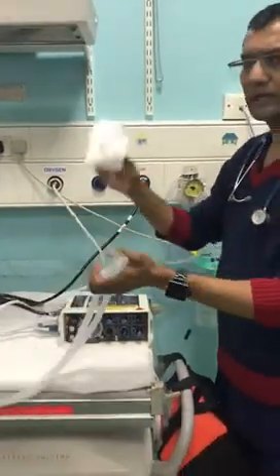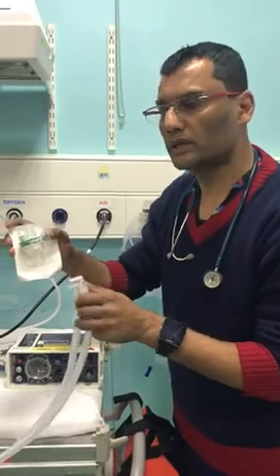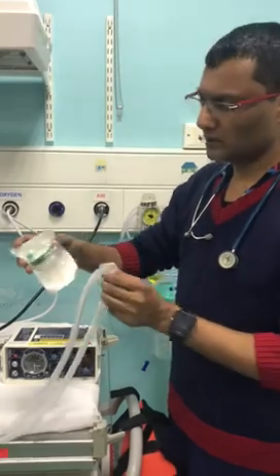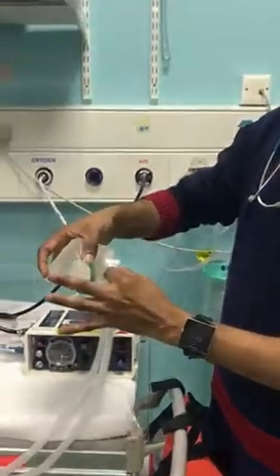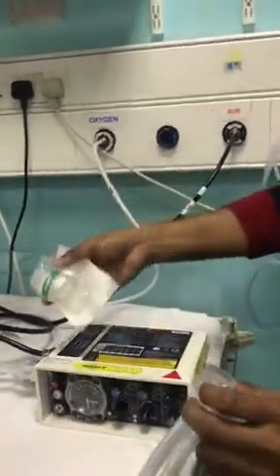Before we connect it to the baby, we usually use a humidifier to trap the humidity. Otherwise, if you're ventilating for a long time, the baby's lungs may get dry and they will develop atelectasis. We try to connect this before connecting it to the tube — it will increase the dead space a little bit, but that does not matter.